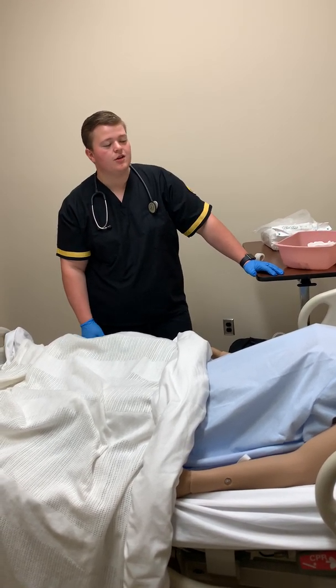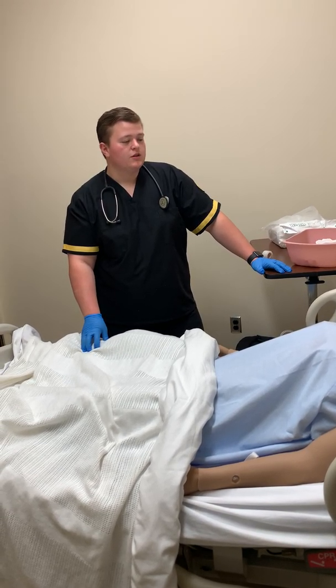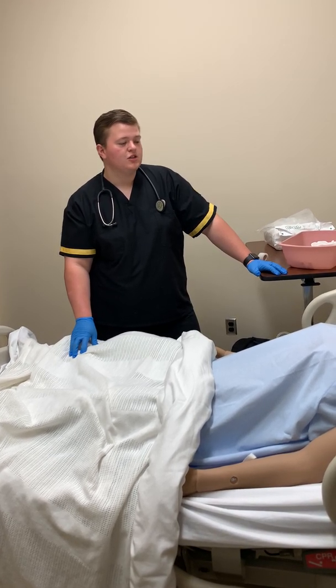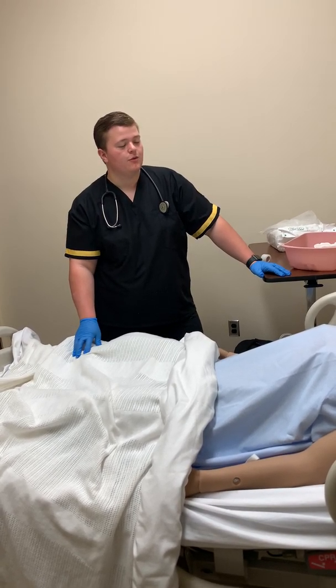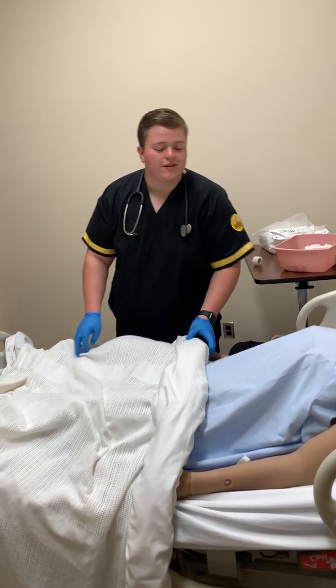No? Alright, sounds good. So the first thing we're going to have to start off doing, Miss Smith, is provide a little peri-care. It's going to help prevent infection. But before we get started, do you have any questions for me? All right, awesome. We'll go ahead and get started.